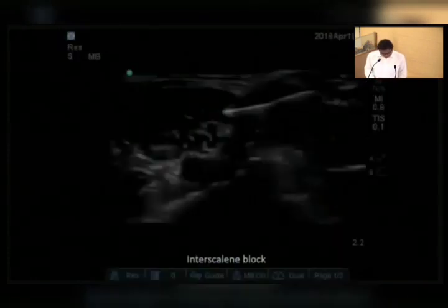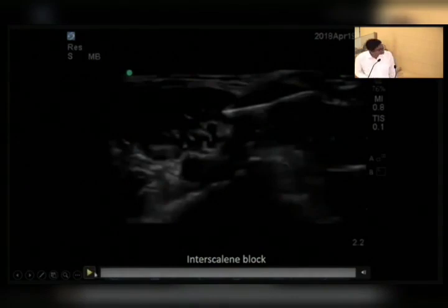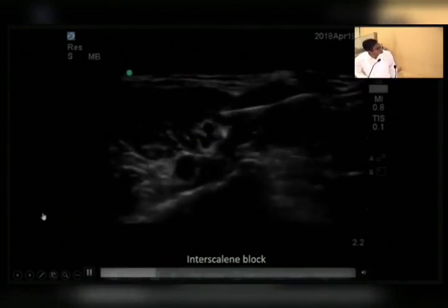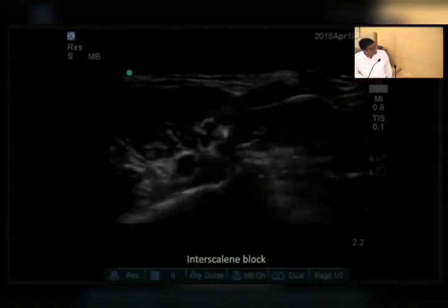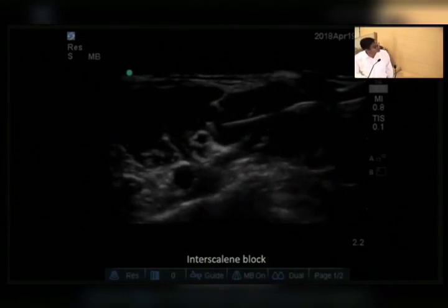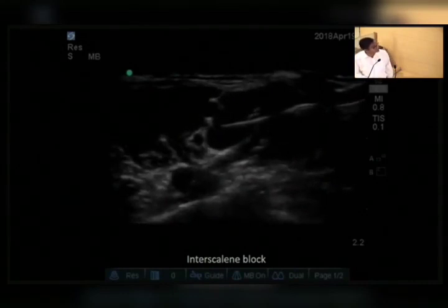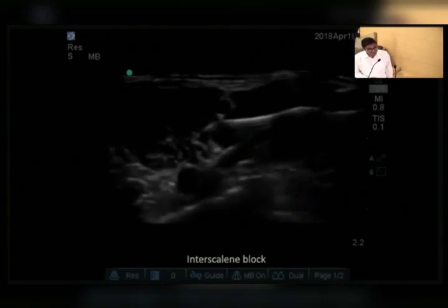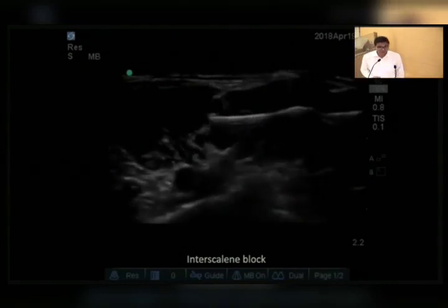Let's see some blocks. Here the needle will come from lateral to medial, piercing the skin and middle scalene, and reach the targeted C5 and C6 roots, and I will inject volume in between the sheath and plexus, that is 15 to 20 ml of local anesthetic. The main idea is that the drug should lie in between the sheath and root. Either single injection or multiple injections, it all depends on drug distribution.